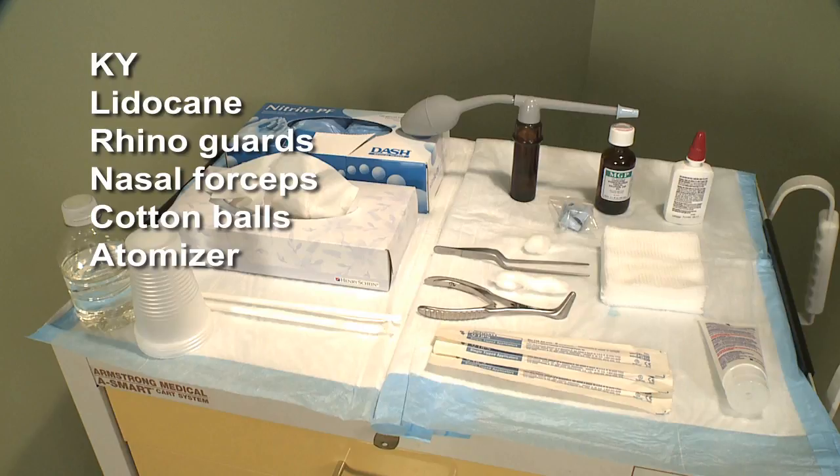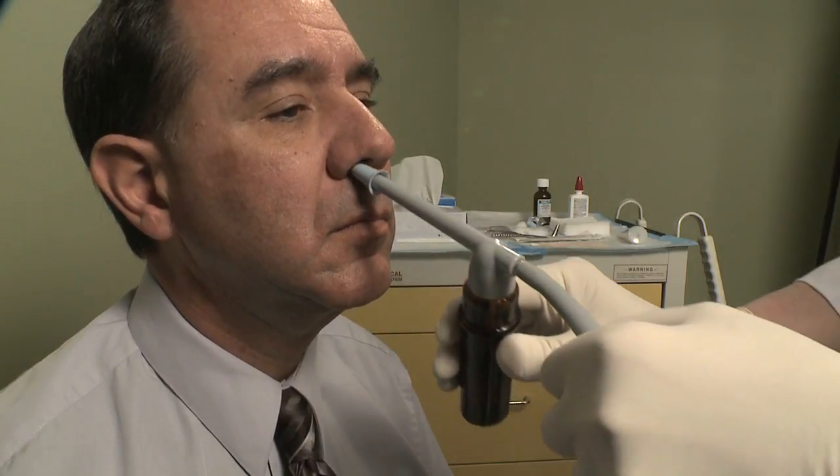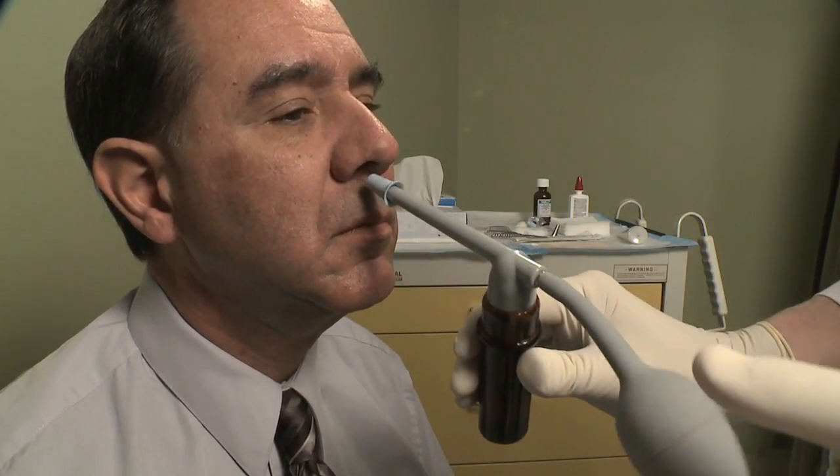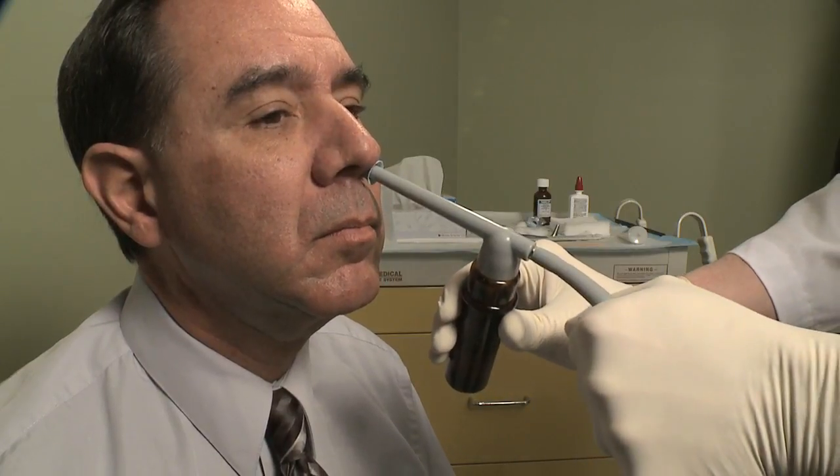Failure to correctly prepare the nose can result in patient discomfort. Patient's nasal preparation typically consists of a 4% afrin-lidocaine mixture used in either a standard spray bottle or atomizer. The patient's nose should be sprayed at least 10 to 15 minutes before the procedure.